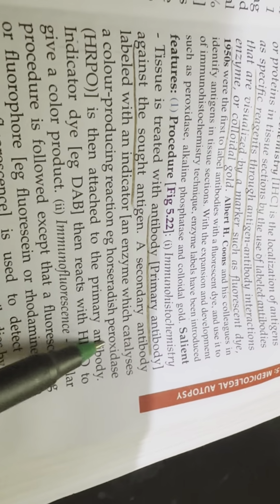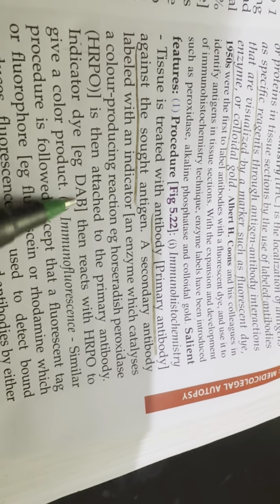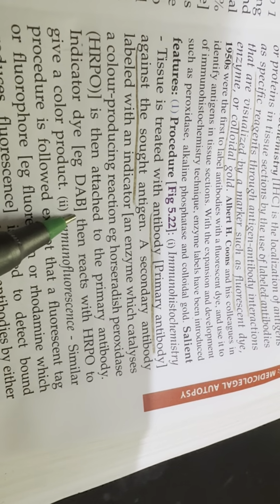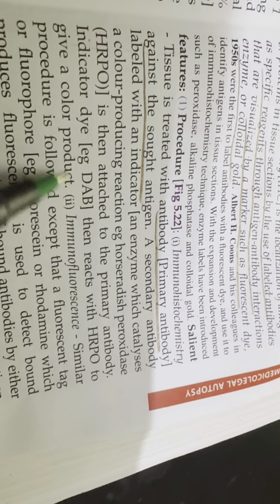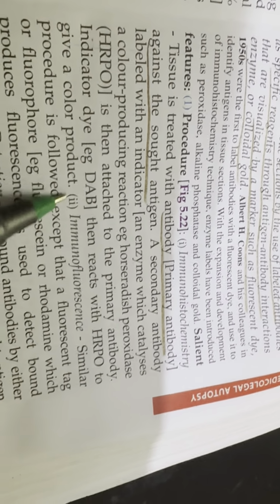Example: horseradish peroxidase is then attached to the primary antibody, indicated by DAB, diaminobenzidine, which then reacts with the horseradish peroxidase indicator to give a color product.